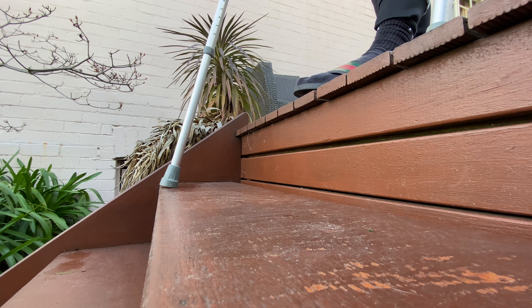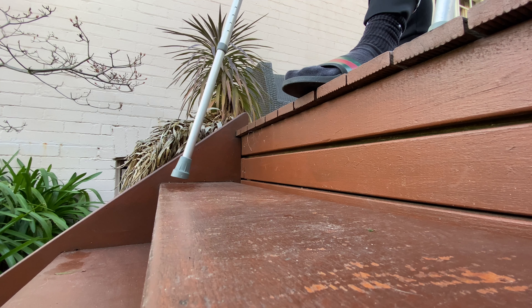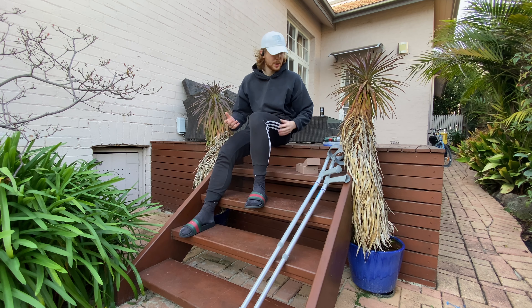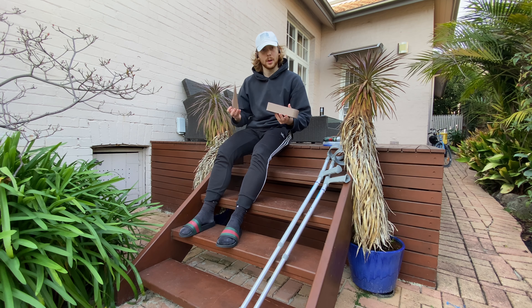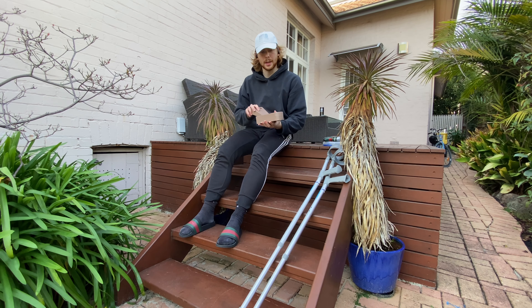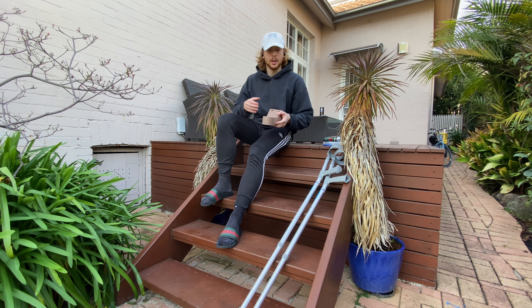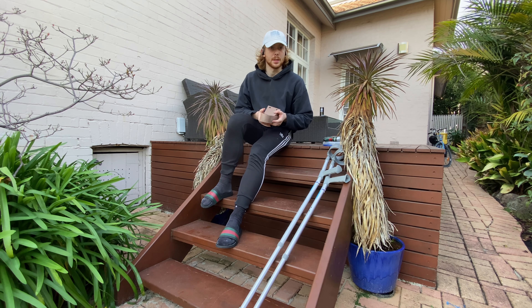He avoids using the steps at all costs so he doesn't have to deal with this situation and risk slipping. So to avoid this issue I developed the crutch anchor. It's a simple device that comes in two separate pieces that easily combine and can be installed, and just acts as a security point to create safety and confidence in descending the staircase.